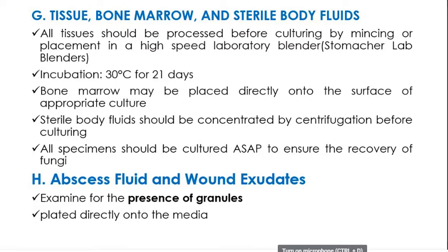Ano ang mode of specimen collection pag ang gusto nating sample ay abscess or wound exudate? Aspiration po, ma'am. Okay. Thank you, Faye. So, we do aspiration. And then, this can be plated directly onto the media. Dito papasok yung mga mycetoma. You have to examine the fluid or the exudate with the presence of granules.